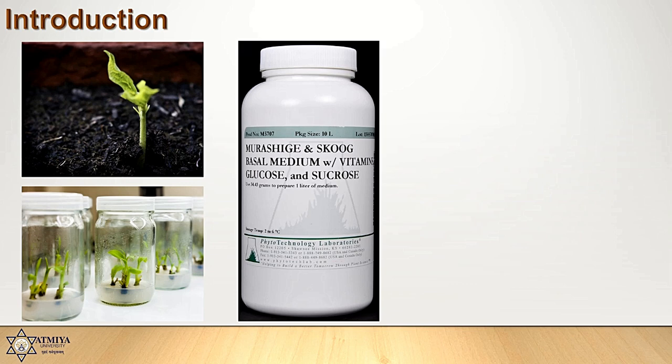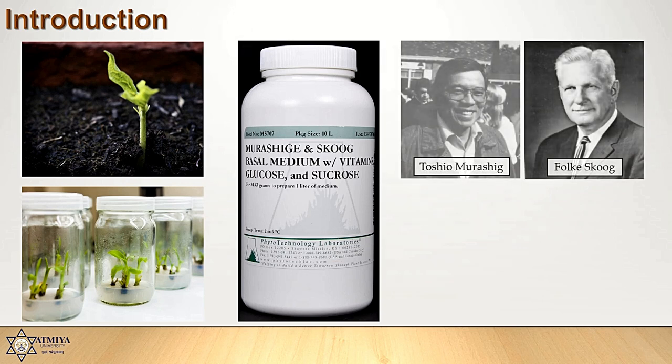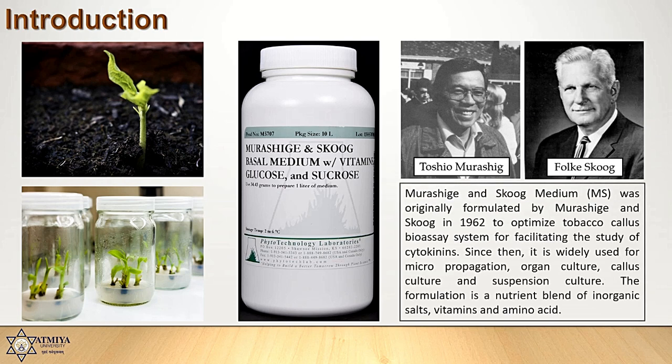MS medium was invented by plant scientists Toshio Murashige and Folke K. Skoog in 1962 during Murashige's search for a new plant growth regulator. Murashige and Skoog medium, MS, was originally formulated by Murashige and Skoog in 1962 to optimize tobacco callus bioassay system for facilitating the study of cytokinins. Since then, it is widely used for micropropagation, organ culture, callus culture, and suspension culture. The formulation is a nutrient blend of inorganic salts, vitamins, and amino acid.